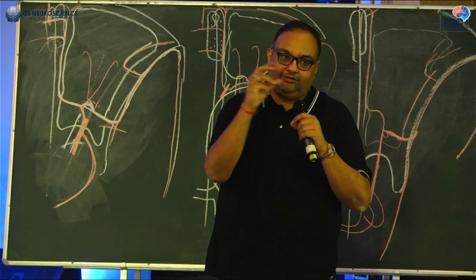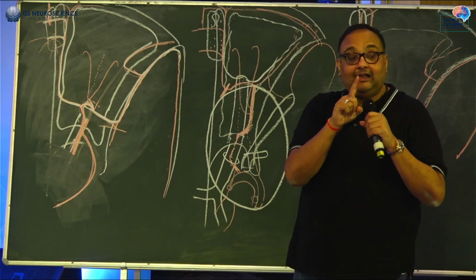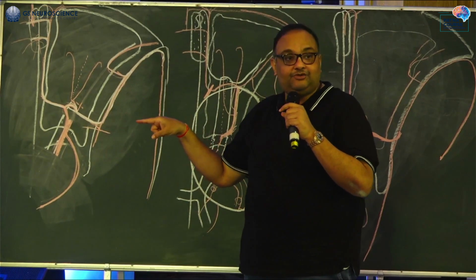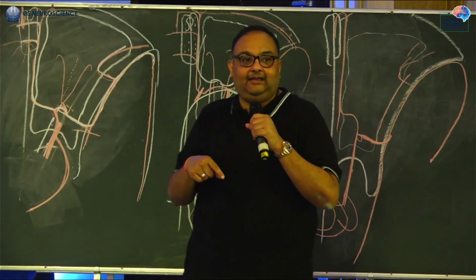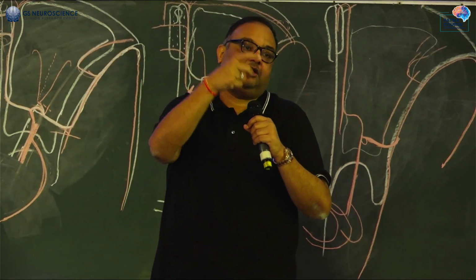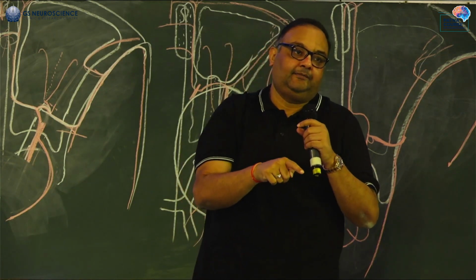See, this was not a typical type C fistula. This was not even a typical CC fistula. Because if you see the runs, the cavernous sinus connection, that posterior-most part that you were seeing there, it is quite possible that it was the anterior compartment of the cavernous sinus, but that anterior compartment was not communicating with the posterior compartment of the cavernous sinus, because there was no flow going posteriorly. So it is also quite likely that you had the variation where the superior and the inferior ophthalmic veins were joining and forming a common trunk, and this was a fistula right at that trunk, post-traumatic.